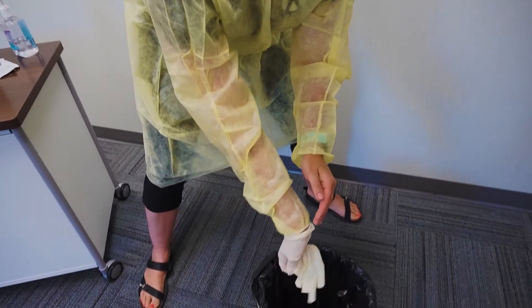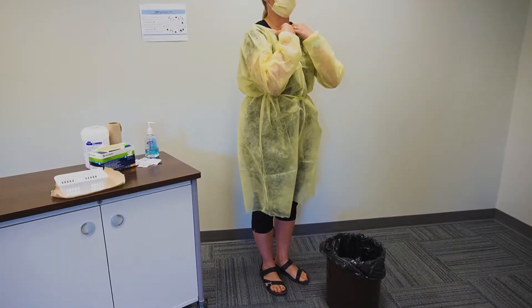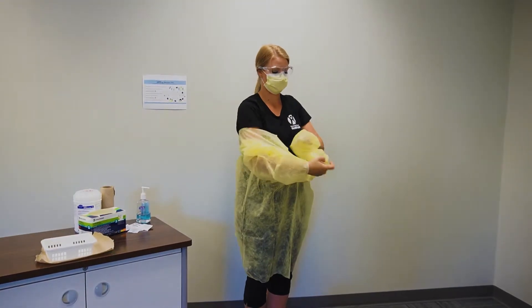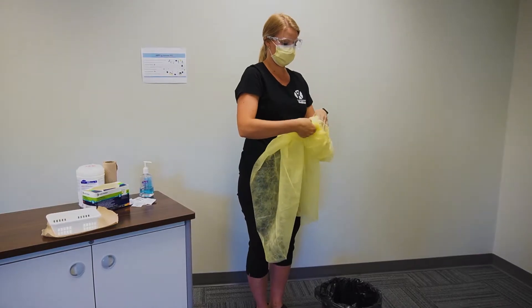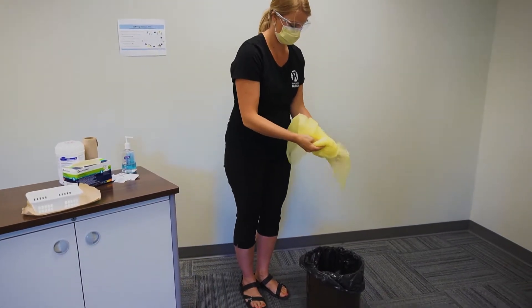Remove gloves by pulling down and away. Remove gown by either untying or pulling from the collarbone down and away to break the ties. Remove by rolling the gown down and away from your body to form a tidy bundle, then discard into the garbage.